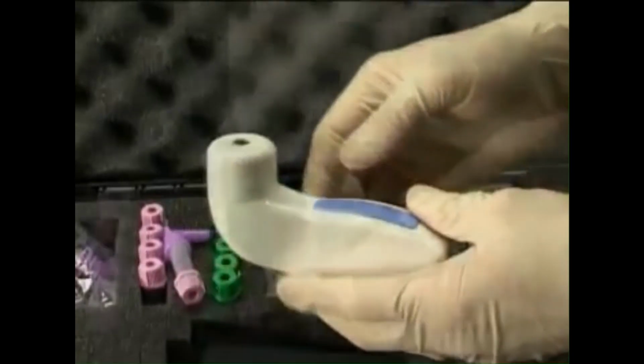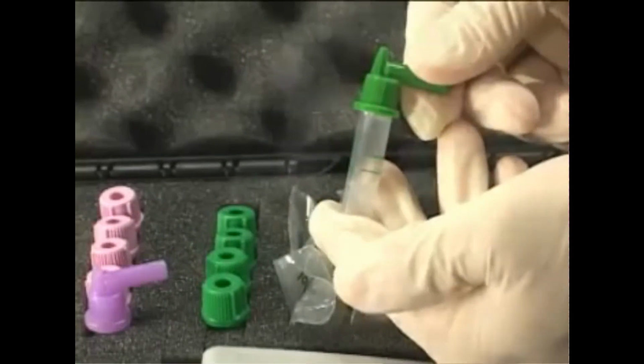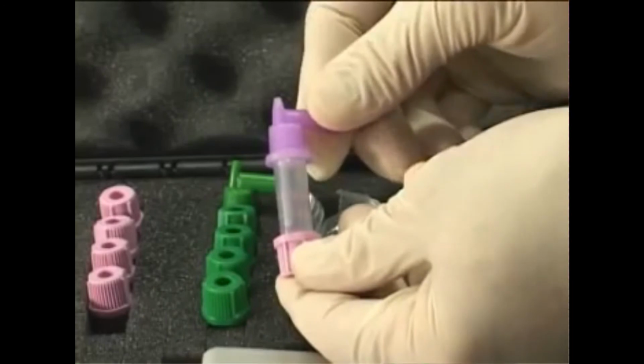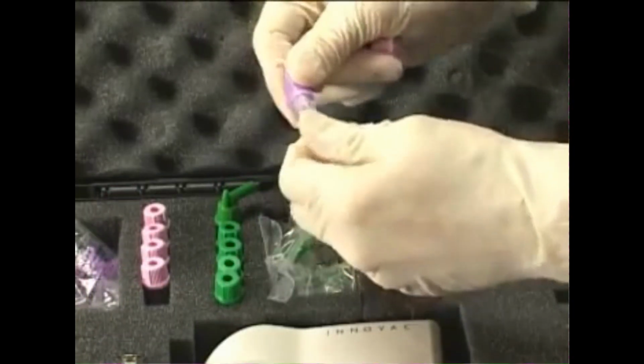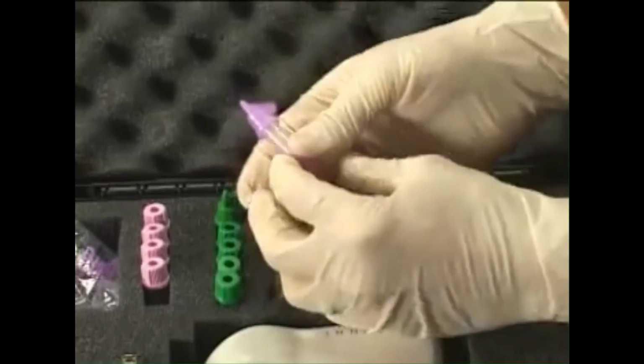The quick draw adapters attach to the BD Microtainer vials for plasma, whole blood, or serum samples. Be sure the adapter is pressed completely onto the container. If it is not, you may experience less than optimum vacuum during collection. Pre-assemble all of the collection vials you will need for this draw before performing the skin puncture.